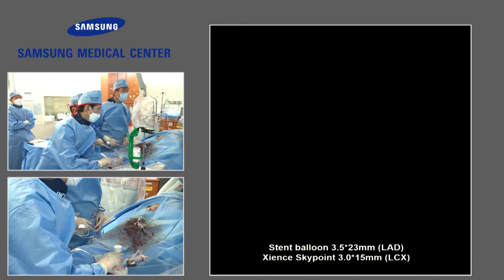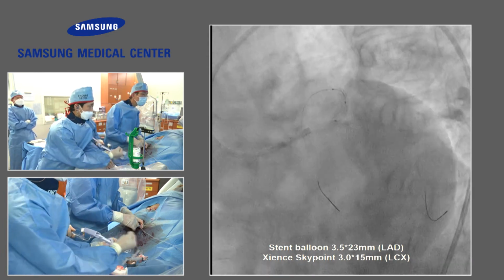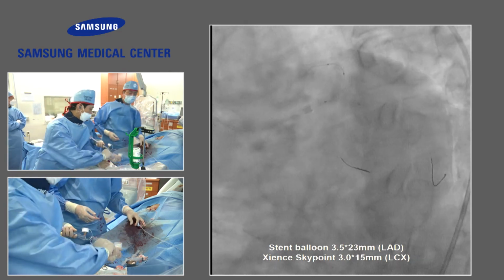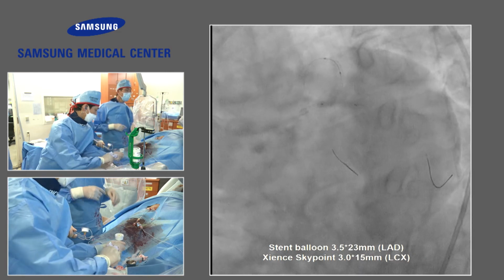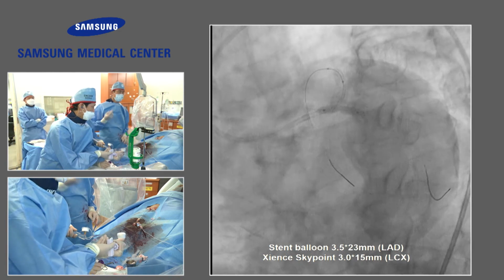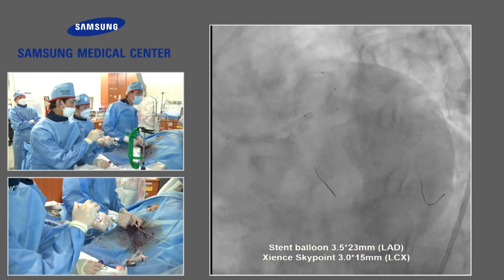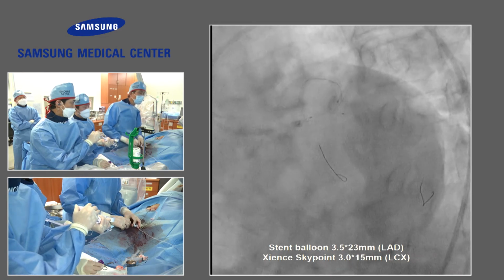Even though you try to get the accurate position of the stent in the provisional stenting, during the inflation process there is some backward motion. So nobody can be sure of the minimal protrusion. But I can easily show you the minimal visualized protrusion by intravascular ultrasound. Of course, that is the reality of the provisional TAP technique. In our series, the angiographically acceptable protrusion was 3.5 millimeters.